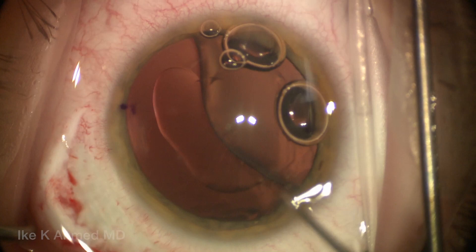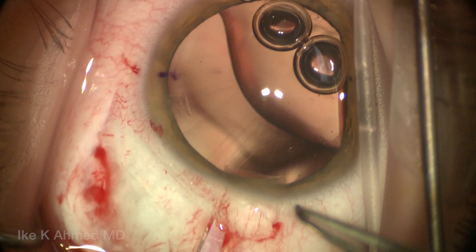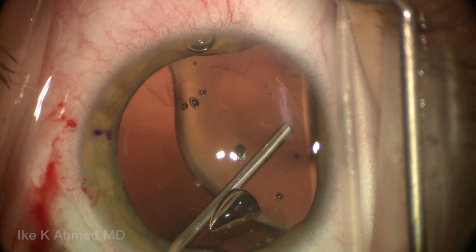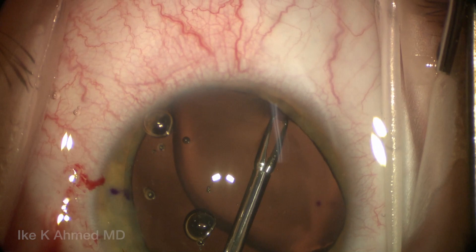A clear corneal incision is made. Here we're going to make three incisions at the posterior limbal area — relatively non-beveled, small incisions, half a millimeter in size — for the iris retractors. A super viscous viscoelastic agent is used to visco-dilate the pupil as well as flatten the anterior capsule. Exposure is going to be a challenge here, so using a super viscous agent is very helpful to pressurize the anterior segment and flatten the anterior capsule.